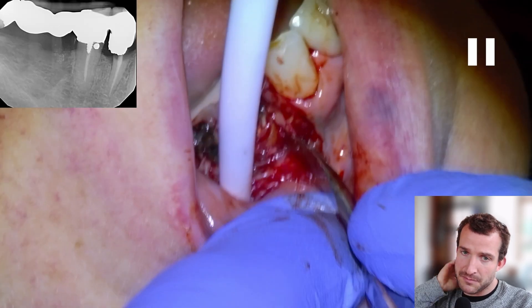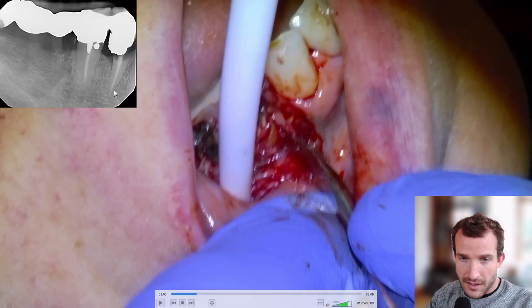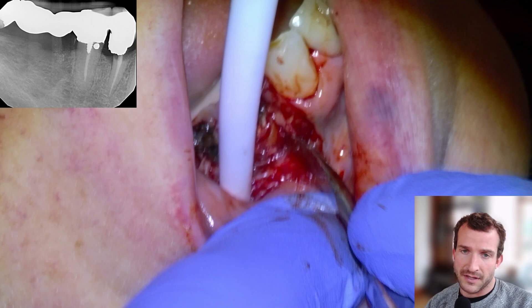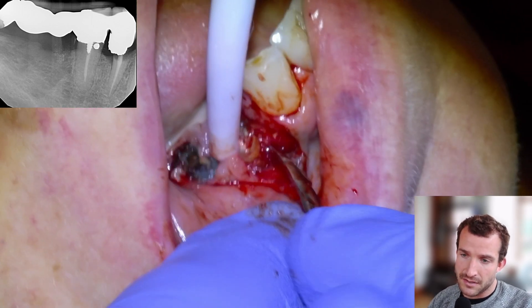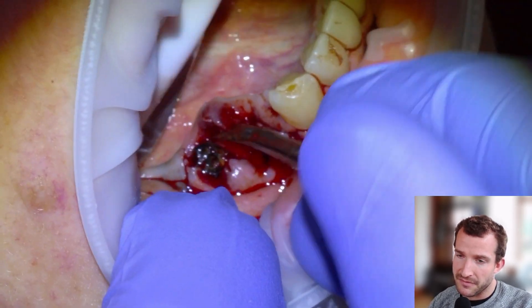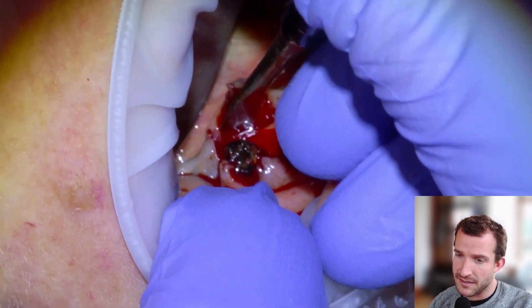There are no symptoms, but you can see here there are no lesions on either of these teeth — they both have successful root canals. So she said she'd do the surgery when she felt like it, so this was the day. We're basically just going to remove the root tips and put a couple of 4.8s in each of the sockets.